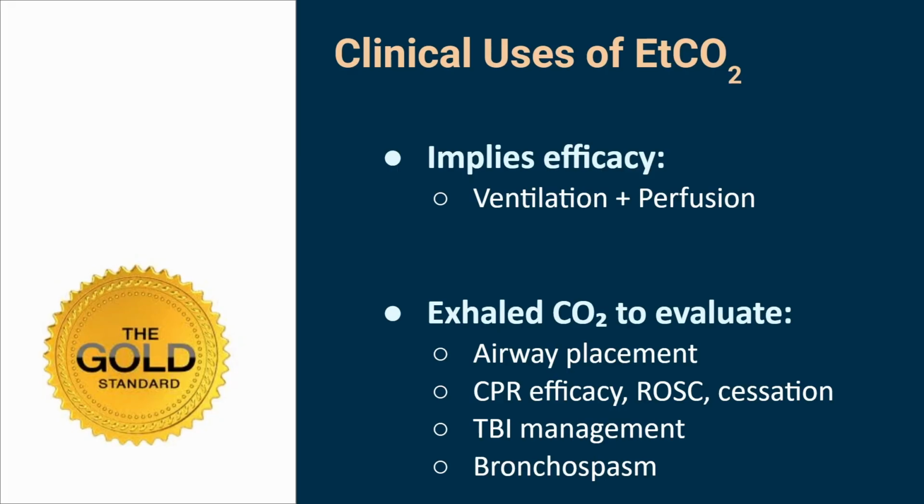Yeah. So you're just using it to verify that you're in the right spot? Are you implying that's the only thing we're using it for? No, but for intubation specifically, it's the gold standard because you're verifying that you have it correctly, or incorrectly? Yes. Okay. You won't get an end tidal reading unless a series of things are happening. You won't get an end tidal unless you are getting gas that is being ventilated from their airway. If you're in the stomach, you will get a 0. You'll get a 2 to 6 for a couple of breaths, and then you'll stay at 0 because gas is not getting exchanged in the stomach.